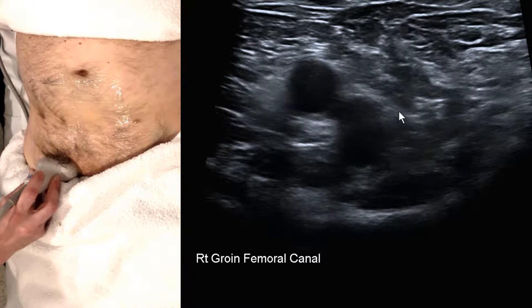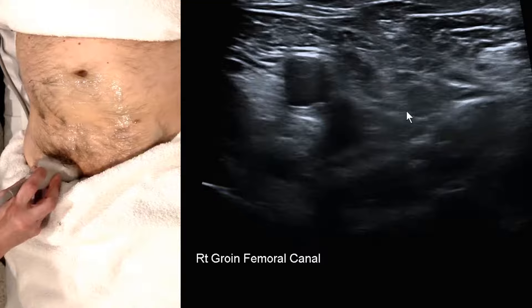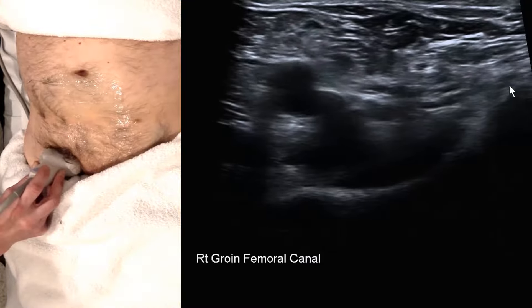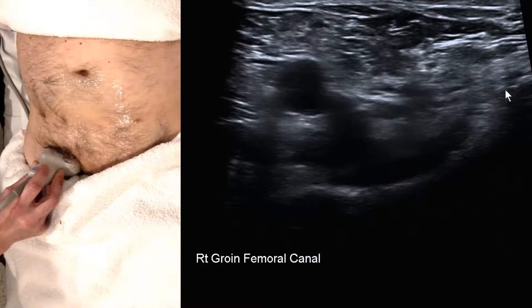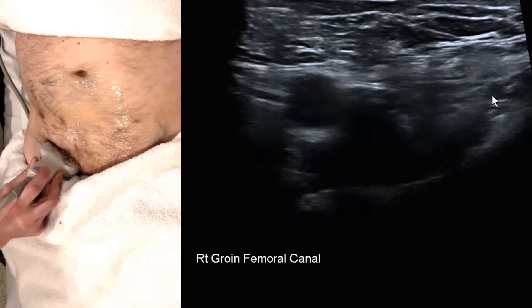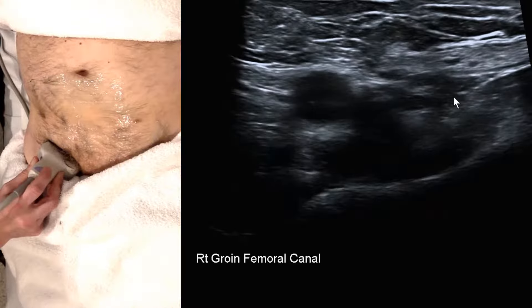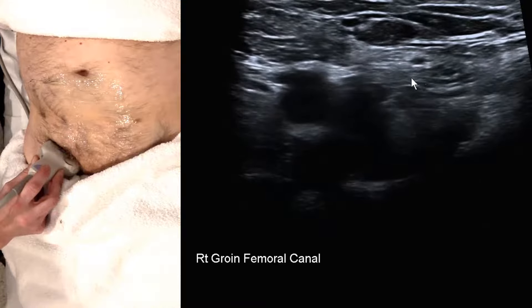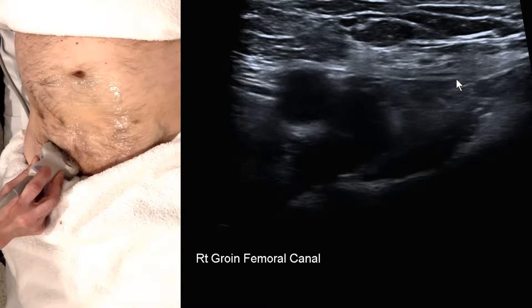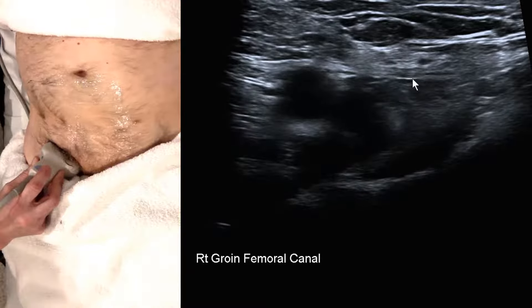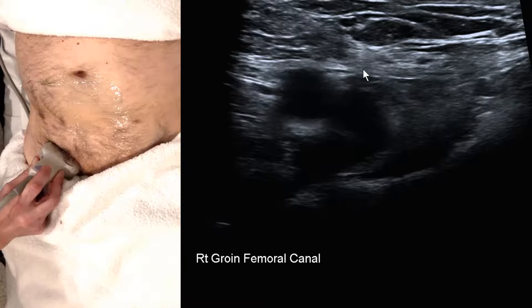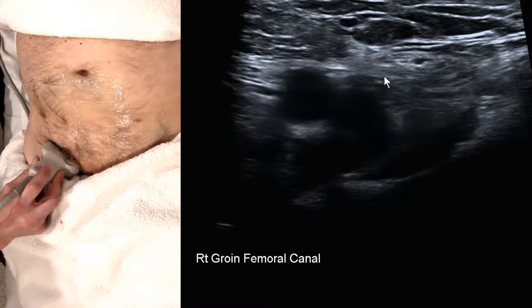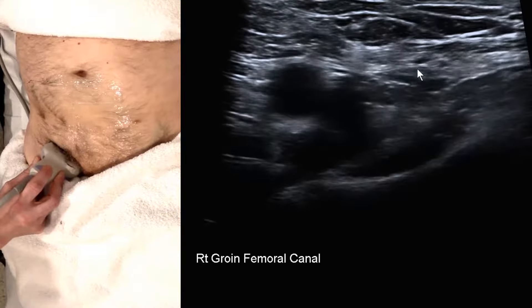Invariably there's some fat and lymph nodes here, all occurring beneath the level of the pubic tubercle and the inguinal ligament, which spans more superficial and anterior to the femoral canal. If we oblique to point from pubic tubercle to ASIS, we see the inguinal ligament overlying the femoral canal.